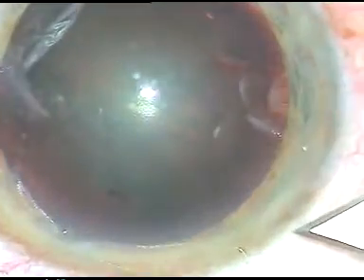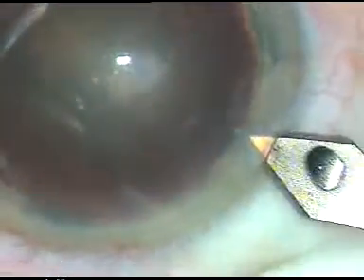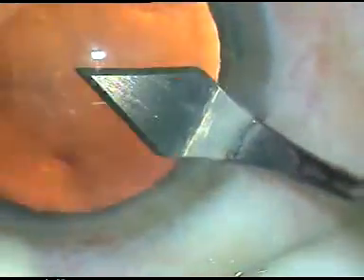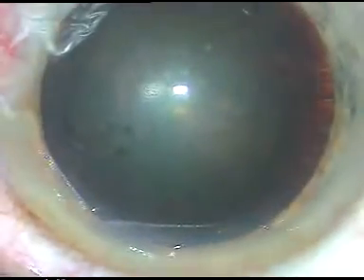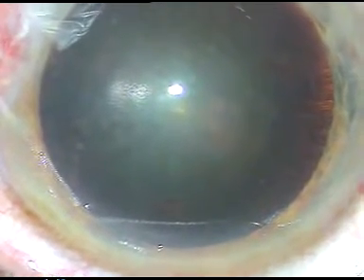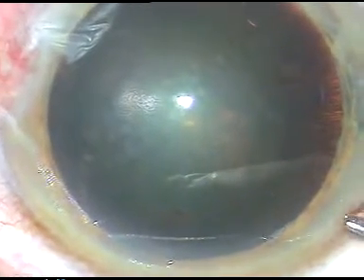Dear colleagues, this is an unedited phacosurgery. The main incision is being placed on the steep axis as determined by corneal topography. It is at around 10:30 o'clock in this case.